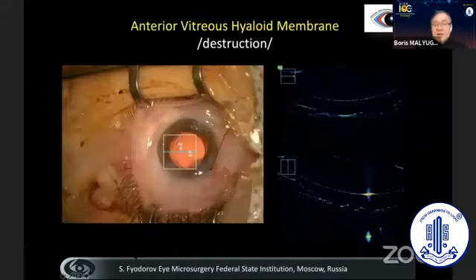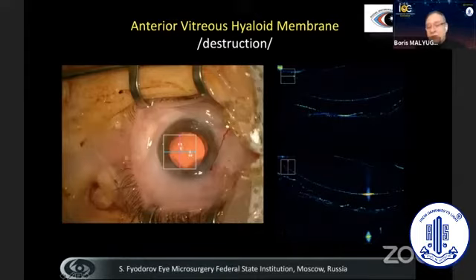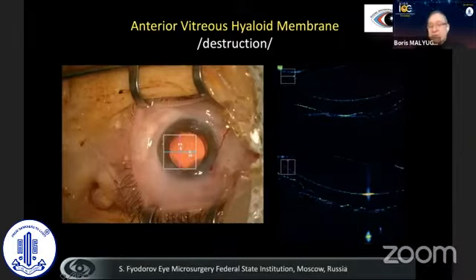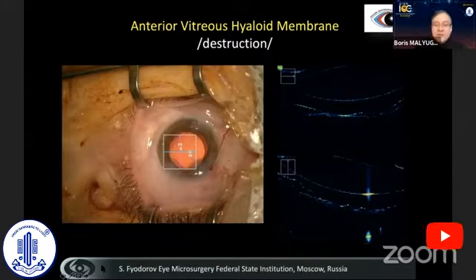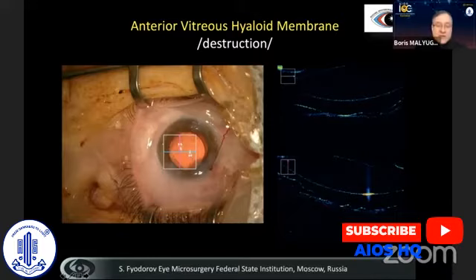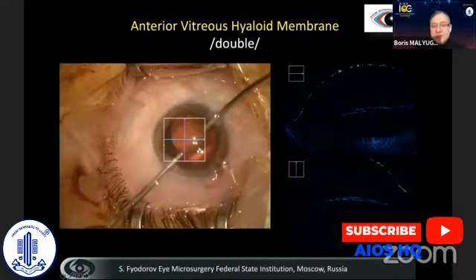In our clinical observations, we've seen different variations of how the anterior hyaloid looks. This is the capsule, and this is the anterior hyaloid — we see that it is not very even, and there is destruction of the anterior hyaloid, which is usually common in patients with advanced cataract and pseudoexfoliation syndrome.